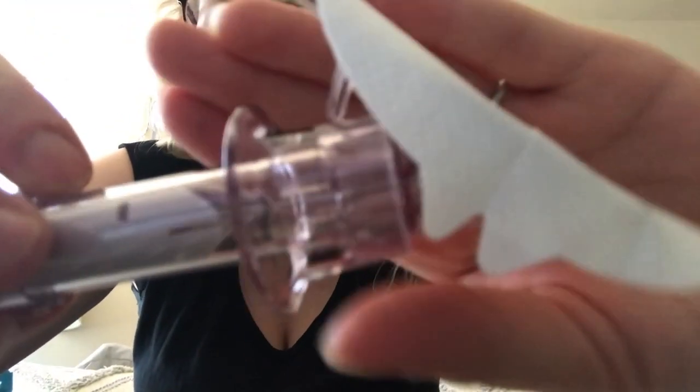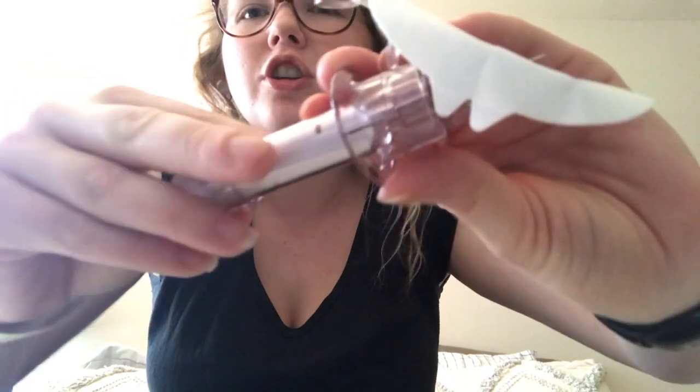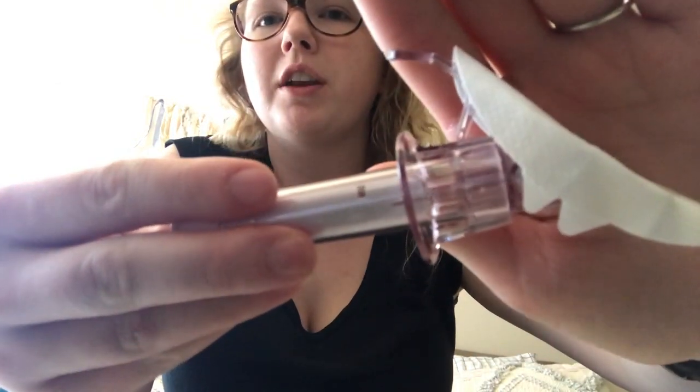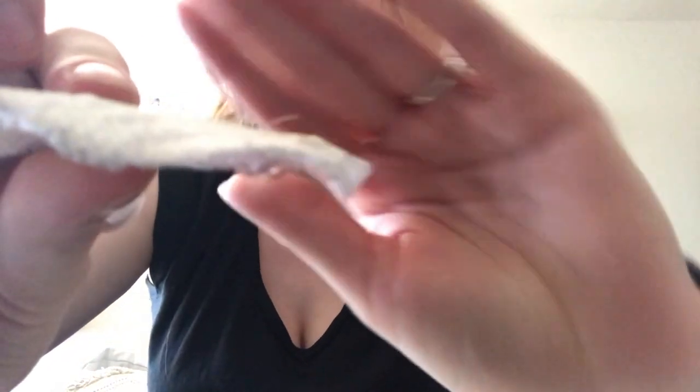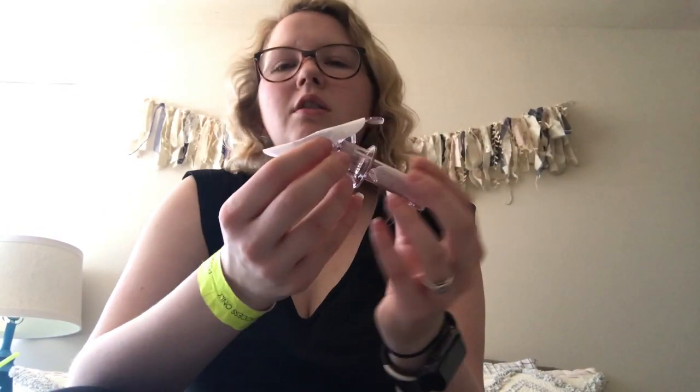This has a protector that I'm going to take out. This has a needle and it is long — you can see it come out — but what's visible is only part of it; it goes all the way from here to there. There's like a catheter on the edge: the needle is going to poke through to get placement, the catheter goes through with it, then the needle pulls out and the catheter end stays in. At the tip of that end are little sensors that are going to check my blood sugar.